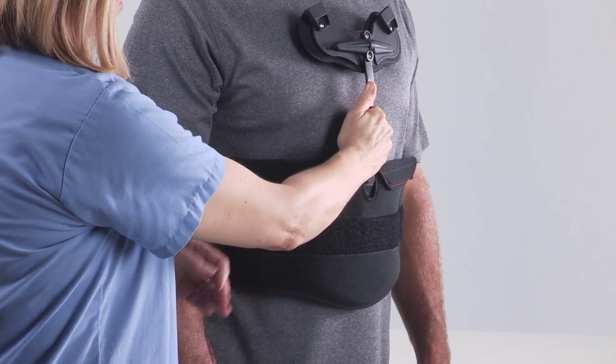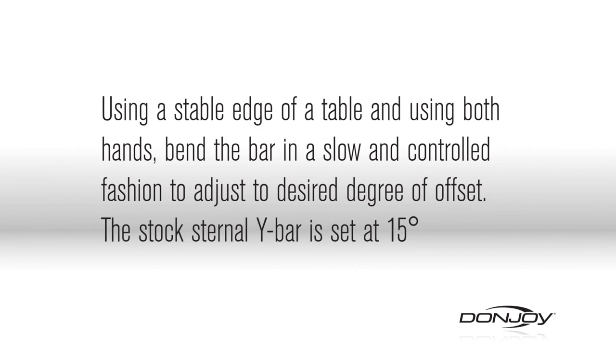Sternal bar. The sternal bar may be bent as needed by using a stable edge of a table. Using both hands, bend the bar in a slow and controlled fashion to adjust to the desired degree of offset. The stock sternal Y bar is set at 15 degrees.